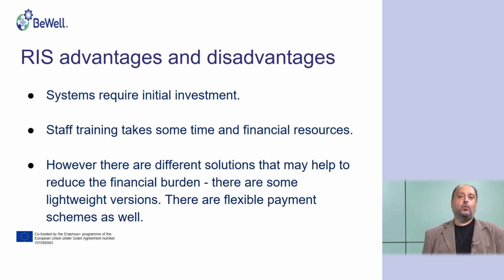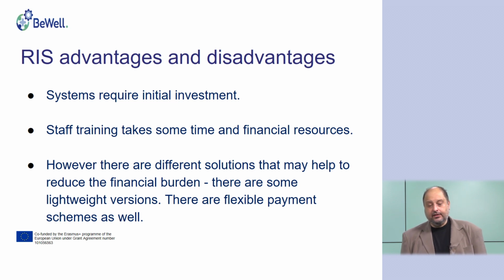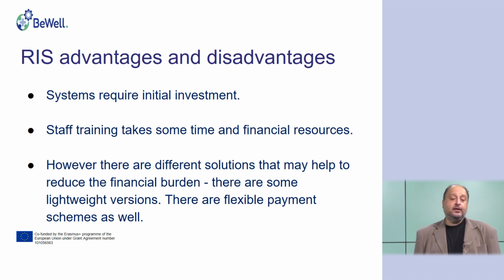Same as with the PACS, the system requires some initial investment and staff training, but of course the staff training is provided mainly by the manufacturer to learn about the functionalities of the system. Of course, there are some concerns about the price, investments, and so on, and there are open versions, same as with the PACS open versions. There are some lightweight versions, some pay-per-exam versions where the fees depend on the number of exams. And there are some other flexible payment schemes as well.